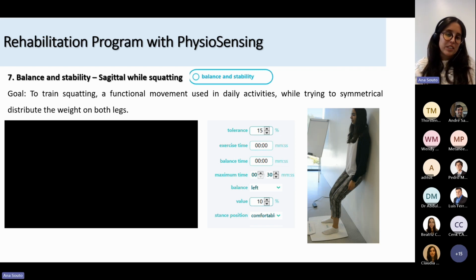Here again, for this patient, of course, we would shift the center to the left, and maybe we would add a chair here, just to serve as a support, not to sit, and it would be something like this. So we want the bar to remain green.